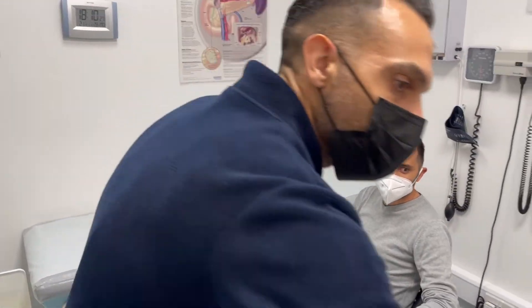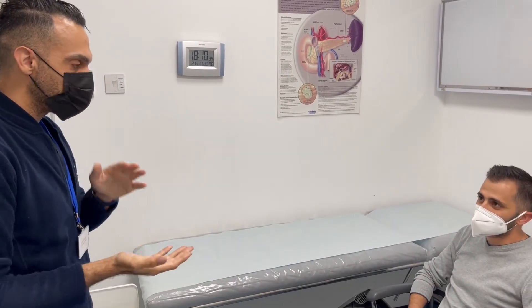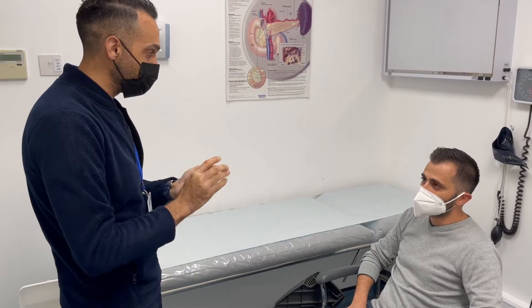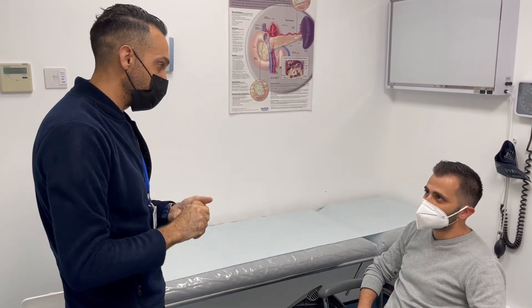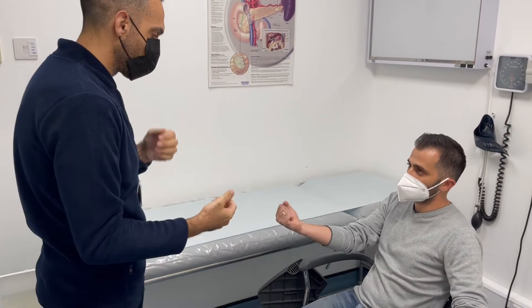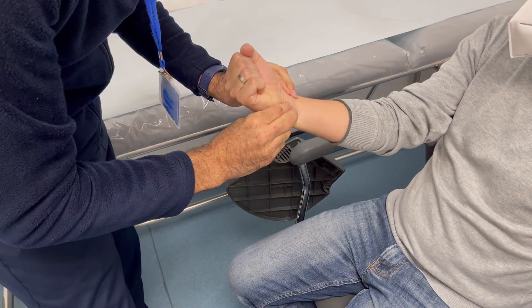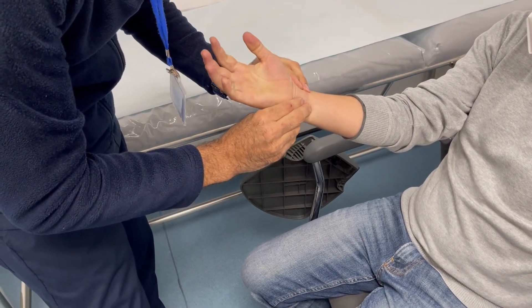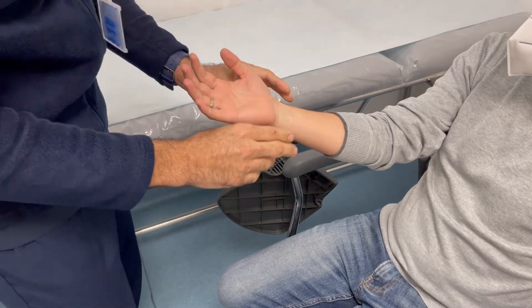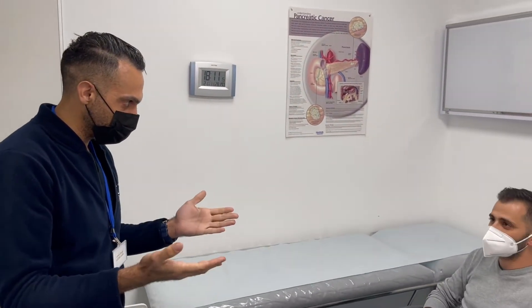Before we get started, I'm going to perform a special test called Allen's test. Since I'm going to be taking blood from one of your arteries, I want to make sure that the other artery is perfectly fine so that it will be able to supply your hand collaterally in case there is a problem with the radial artery. I'm just going to ask you to make a fist for me. Excellent. I'm going to go ahead and occlude both the radial and the ulnar arteries, and you can open your fist for me. I'm going to release the ulnar and we can see that the nice red color is coming back. This is a positive Allen's test, so we can proceed with the procedure. Are you happy to proceed?